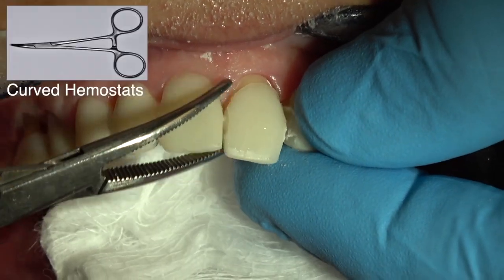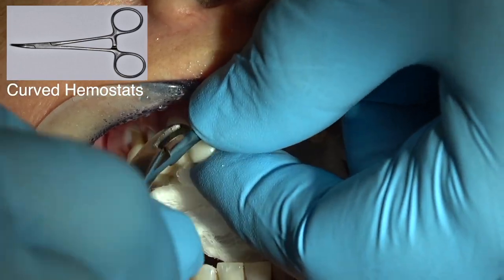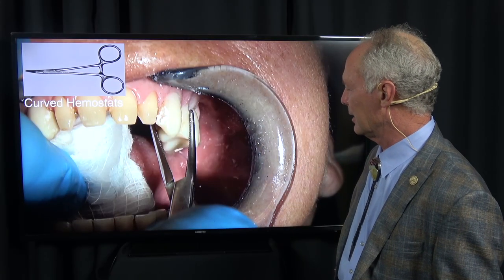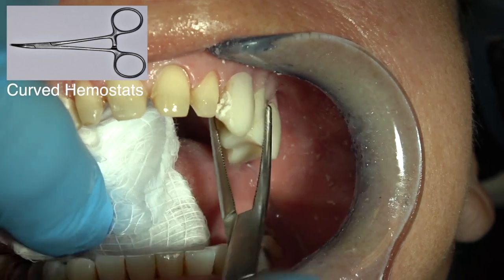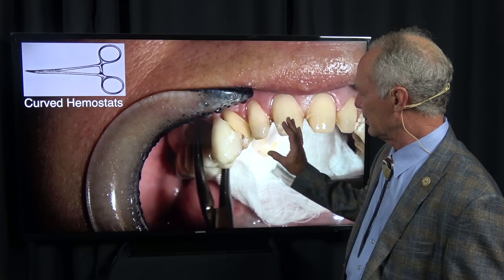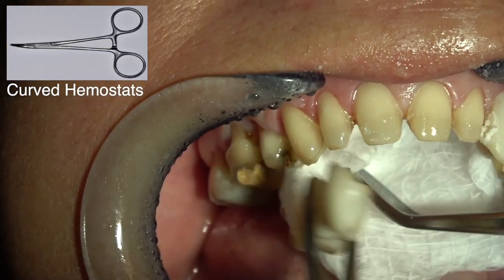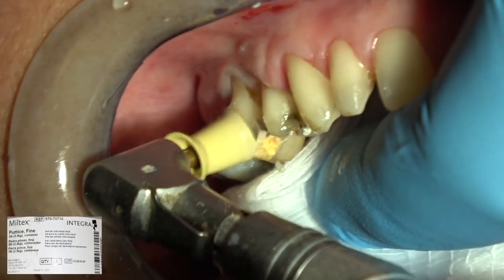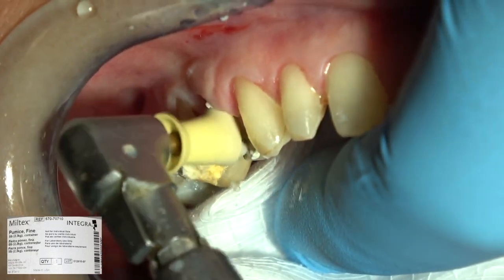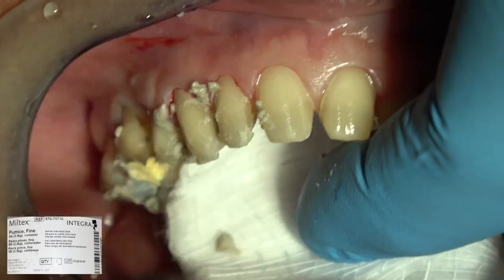So they'll just torque off. Always put a two-by-two in the mouth - that's why I use a rubber dam on almost everything. I don't want anything falling in the patient's mouth and the patient swallowing or aspirating it. Olympia cement has just about the perfect strength - strong enough to keep the provisionals on the teeth, but you can remove them when you torque them. After removing the provisional restorations, I'm going to pumice the teeth with a rubber wheel and pumice in water.